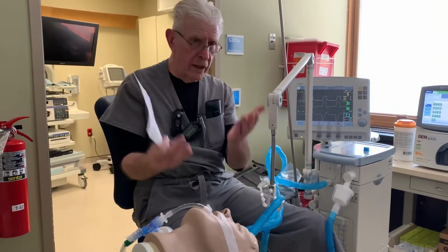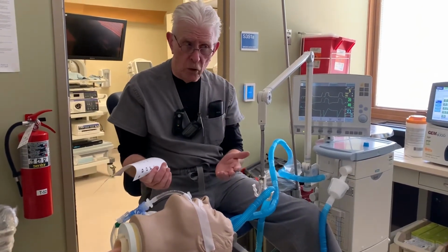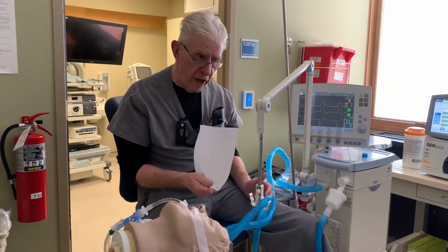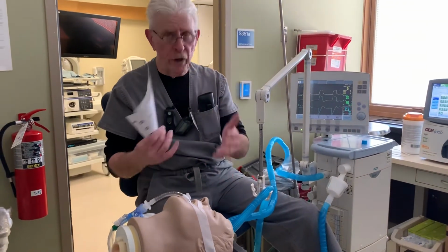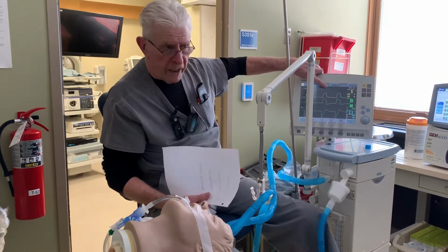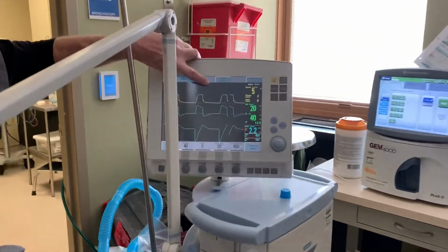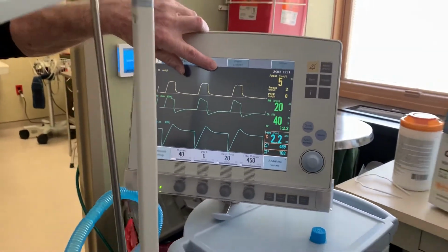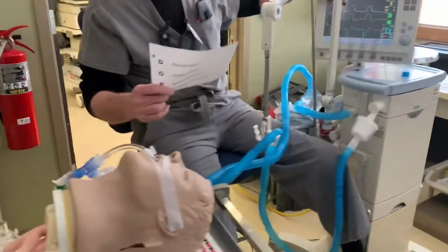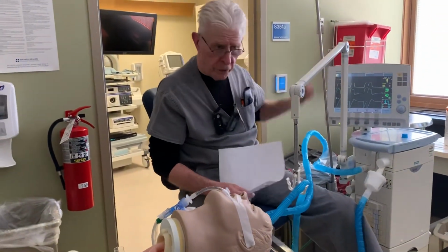There's usually a balance that you're creating between how much sedation you're giving an individual so that you can provide support for them, while at the same time allowing them to take a spontaneous breath. On this ventilator, recognition of a spontaneous breath, though you don't see it here, is a little purple T that will show up on the screen. That says that the machine is recognizing a breathing effort that the patient is making and shows you that it's triggering the machine.